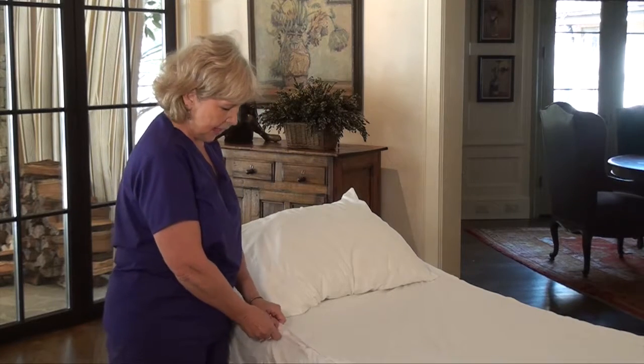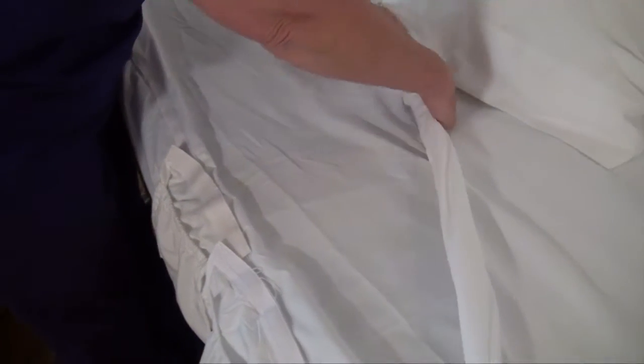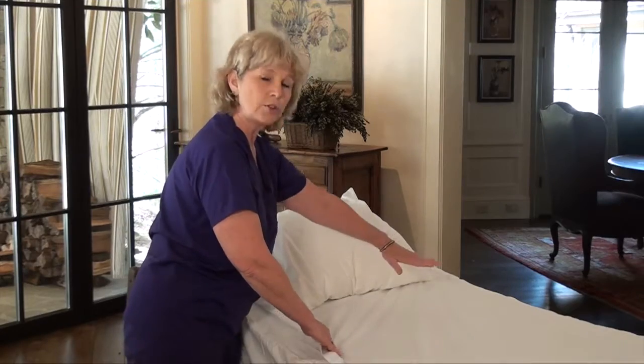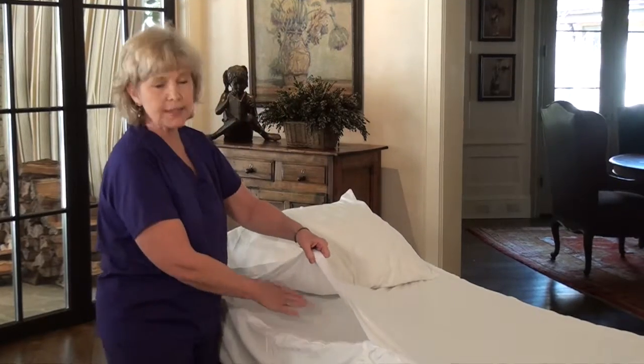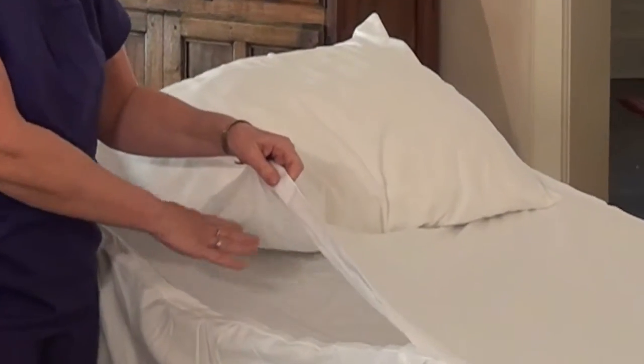I can take this sheet and the Velcro strips tear very easily. If the top sheet gets soiled, I can roll this sheet and put it underneath the patient, and what's really nice is underneath is where we can now put our incontinent pads.